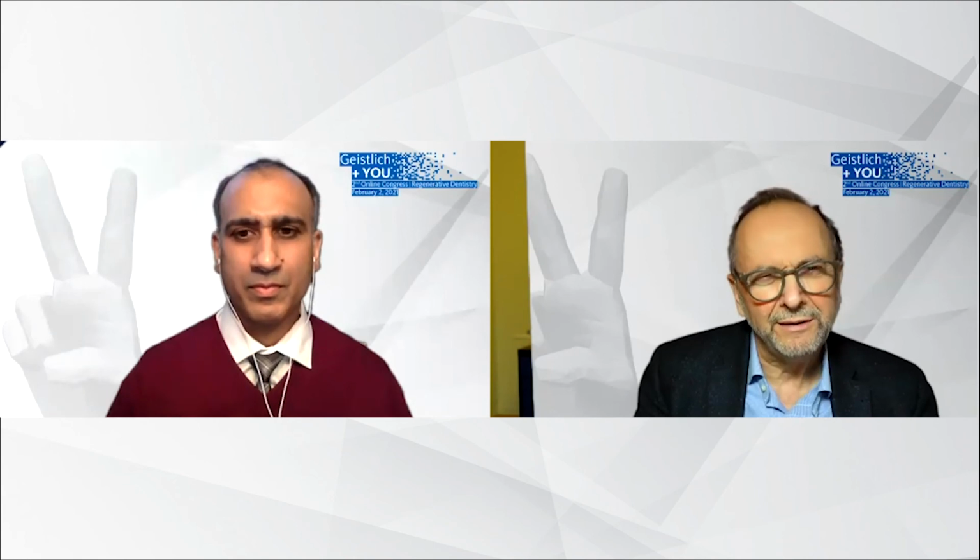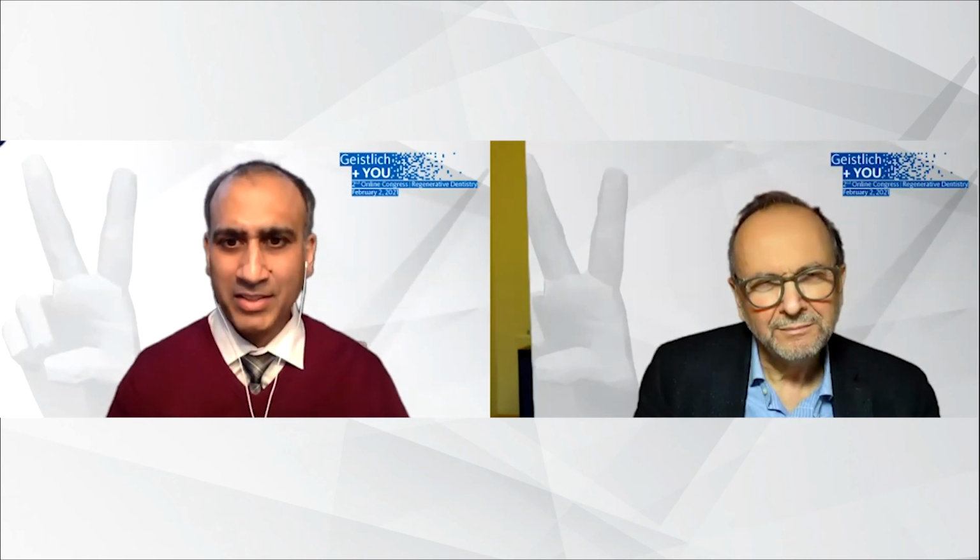Speaking quite truthfully, I think in the maxilla there's a lot of room for success. Most of the cases that I do with this material for multiple recessions tend to be in the maxilla, because vestibular depth doesn't seem to be as much of an issue, and quality of tissue doesn't seem to be an issue. So your initial starting conditions are already quite good.